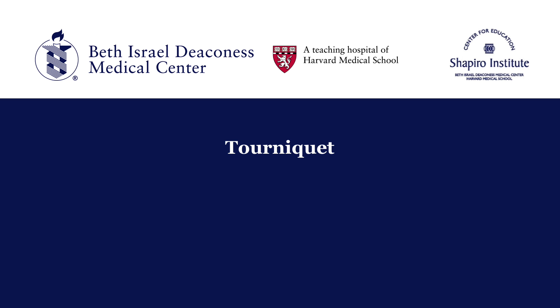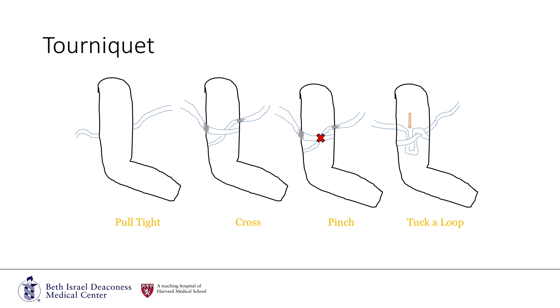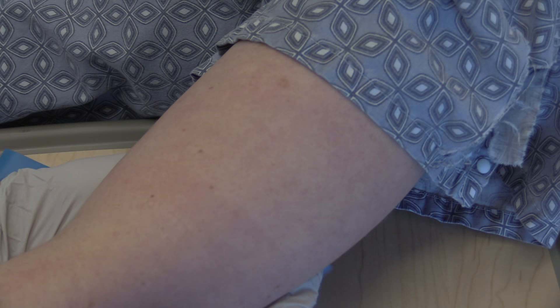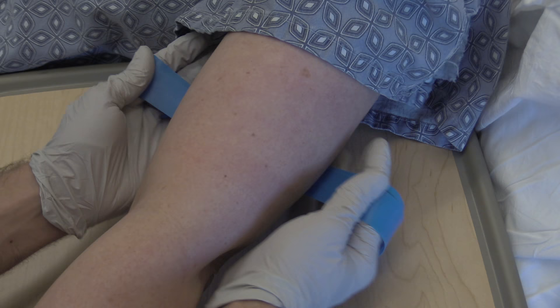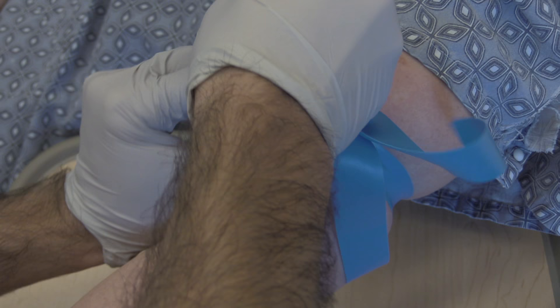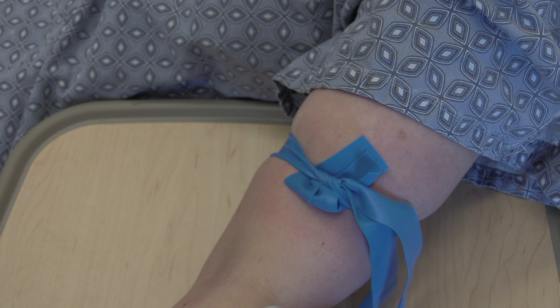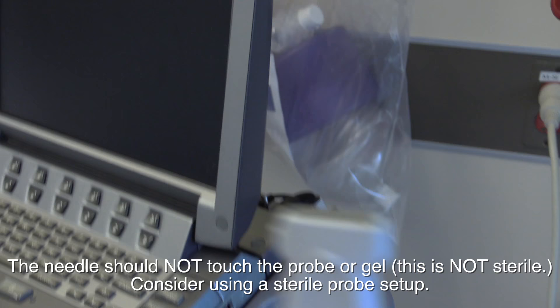The next step is to identify an appropriate target vessel for cannulation. This is often best accomplished by applying the tourniquet to the proximal arm. I prefer to use a double tourniquet technique to make veins more prominent and to avoid slipping from ultrasound gel that gets into your tourniquet knot. Grasp the tourniquet between your thumb and index finger in both hands, touch your small fingers together to judge the proper length, stretch the tourniquet across the arm and cross your wrists, then tuck a loop of tourniquet into the knot. It's best for extra tourniquet to be directed proximally and out of your procedure field.